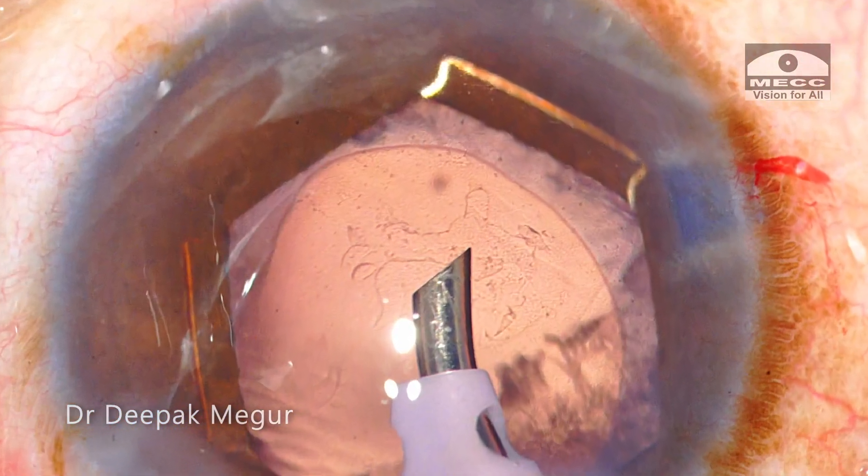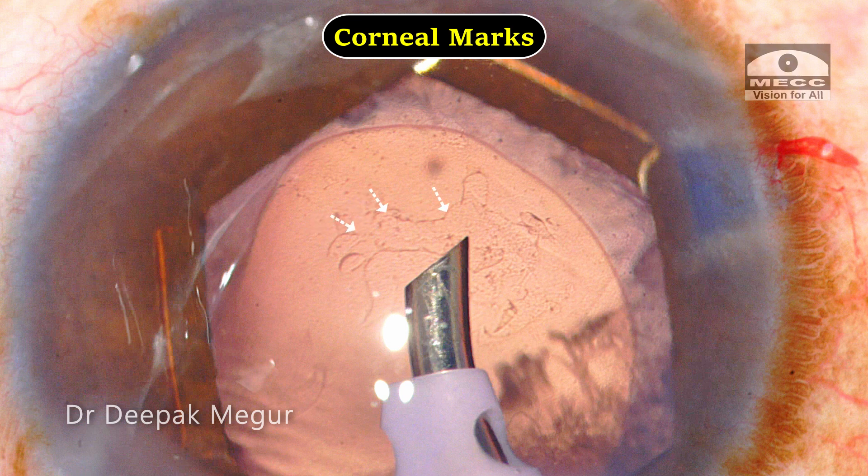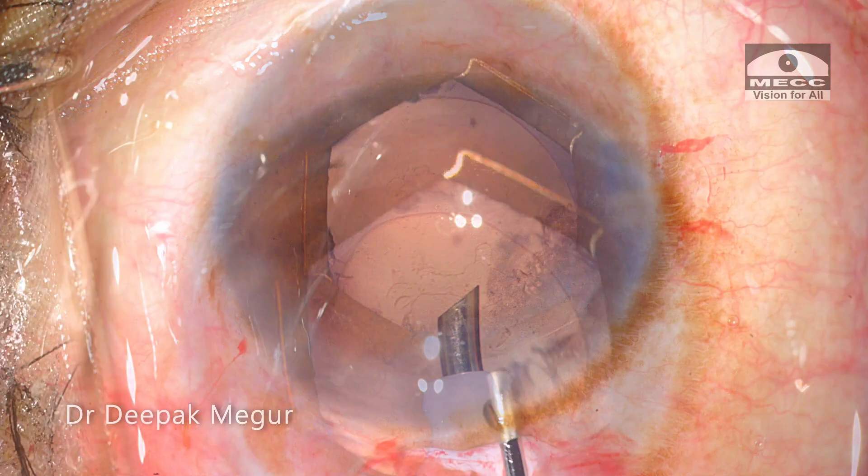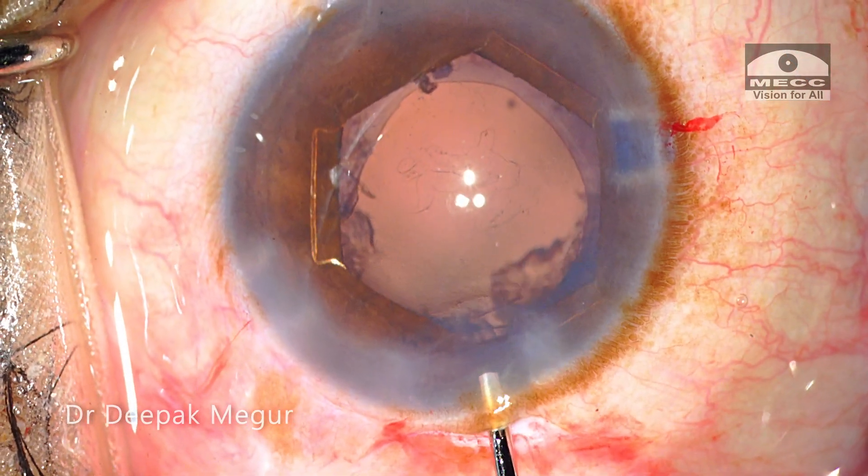At this point, I want to pause and demonstrate the marks on the endothelium which are suggestive of mechanical trauma to it. It would be interesting to see how the cornea looks the next day. Eventually, the emulsification of the nucleus is complete and now is the time to remove the cortex.